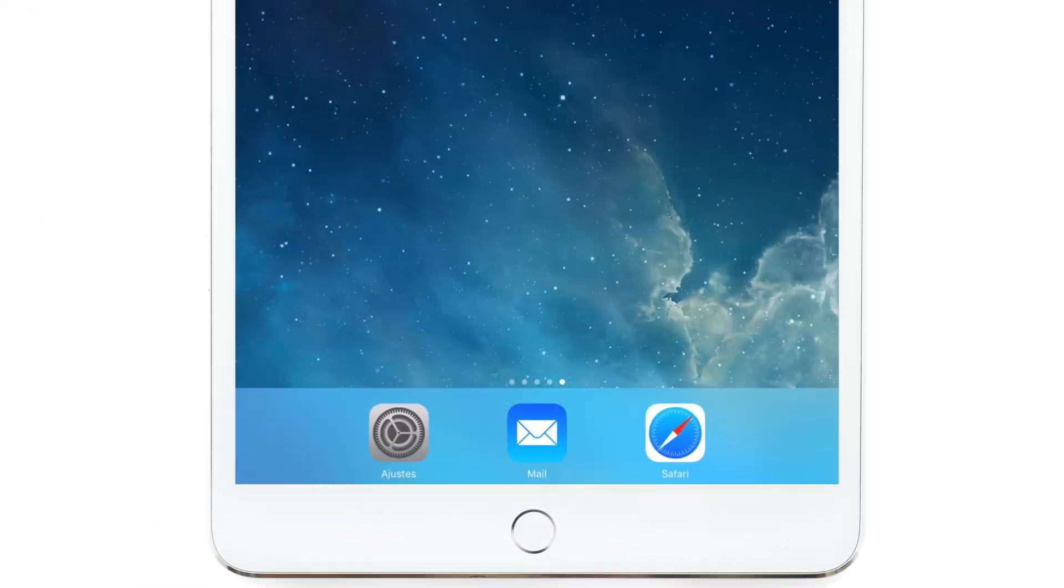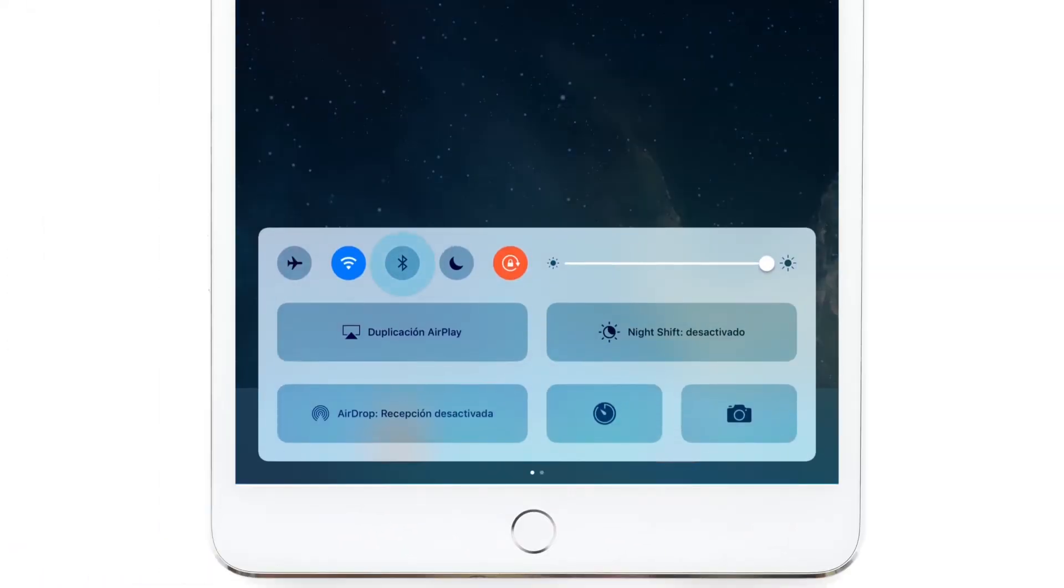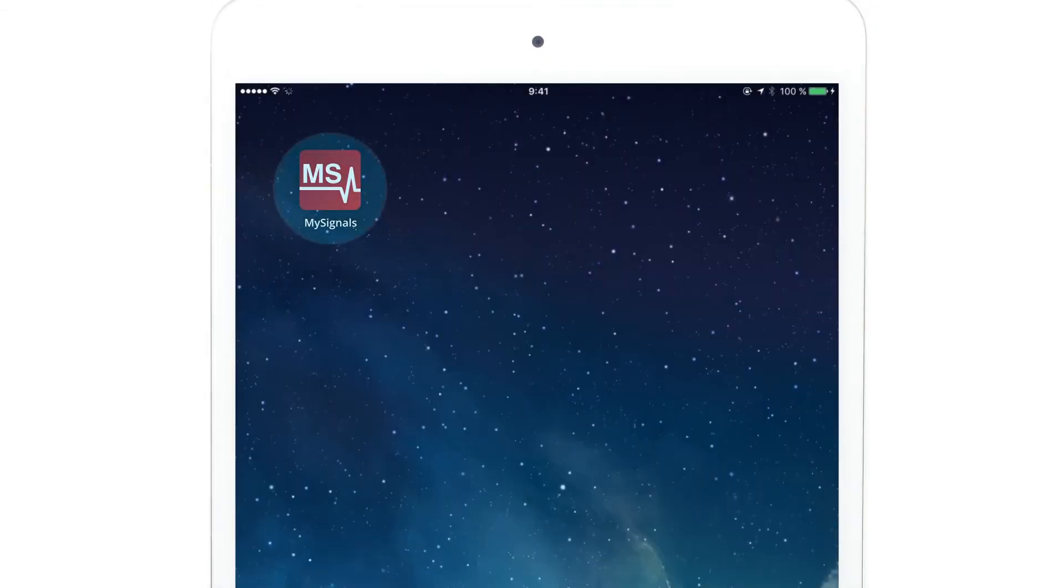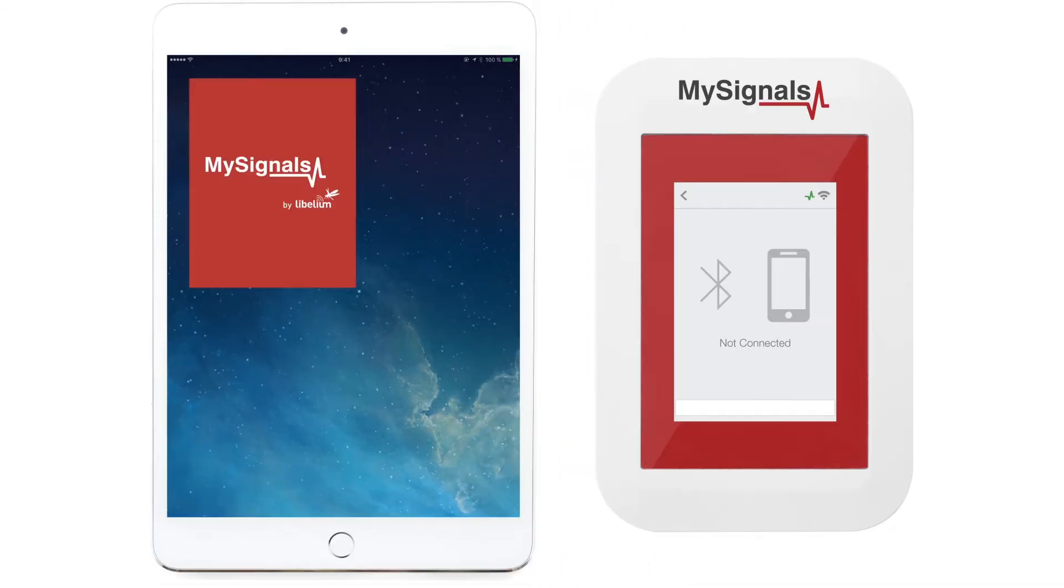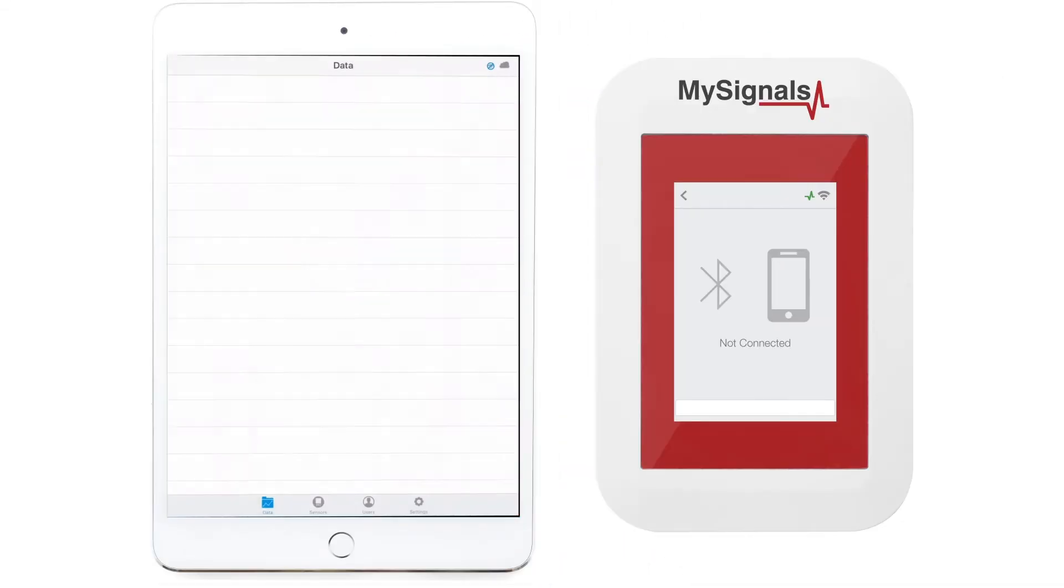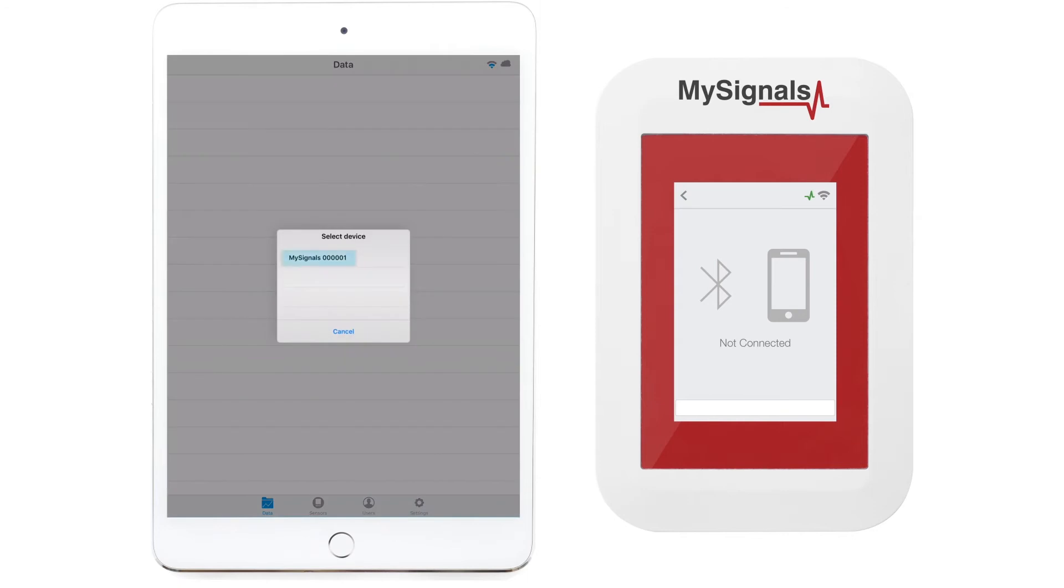Switch on the Bluetooth connection on your tablet. Go to the app and select the MySignals device you want to connect to.